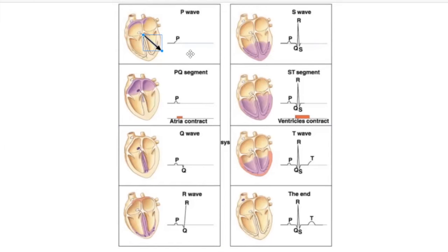Now when we go down to the Q wave, rather than pointing off angle like this, it's mostly pointing down a little bit towards the end of the P wave. Then during this PQ segment, there's not really anything noticeably activated. The Purkinje cells and the His bundle, these specialized highways, are activating, and if we got in close enough we could see little dipoles pointing down them. But when we're far enough away we can't really see those, so the vector goes away completely. We don't see anything.